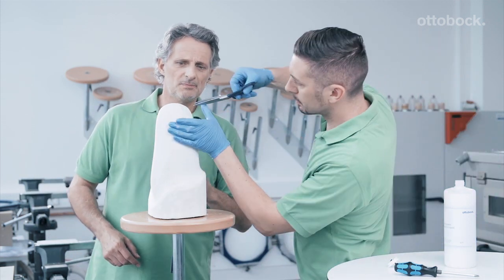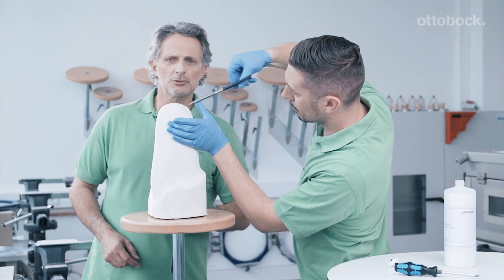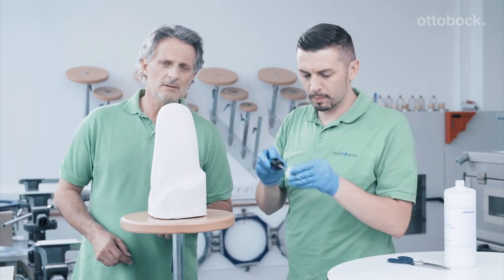Here is the location where we screw in the valve dummy. We cut a hole in the residual limb sock and then screw the dummy in.